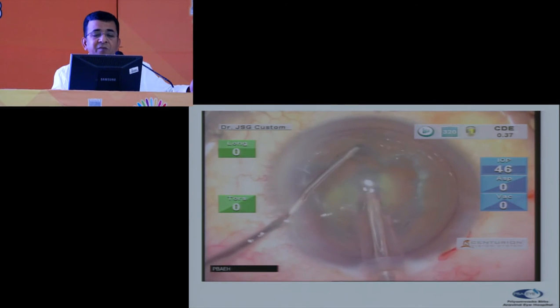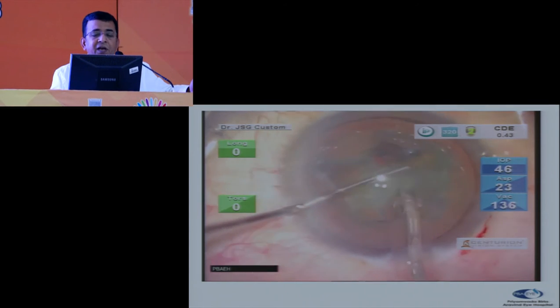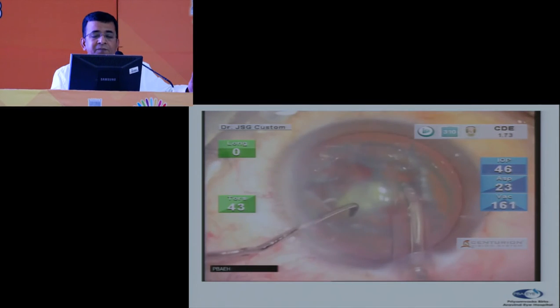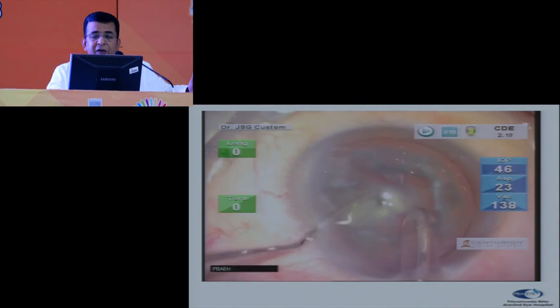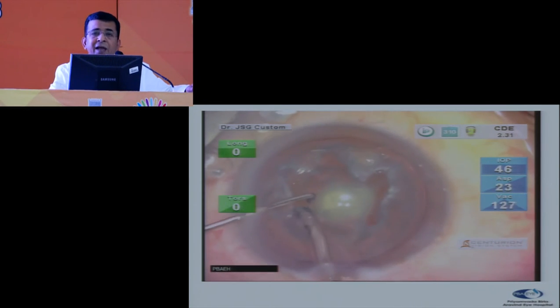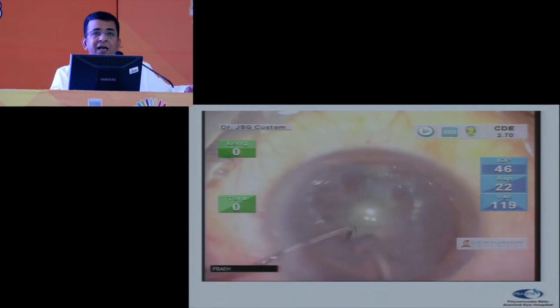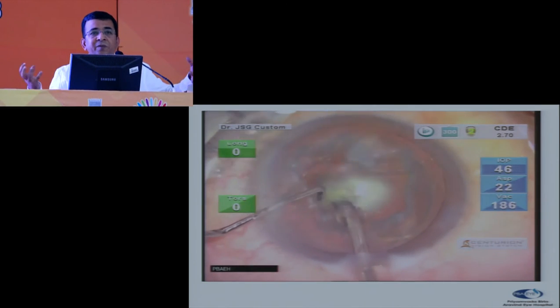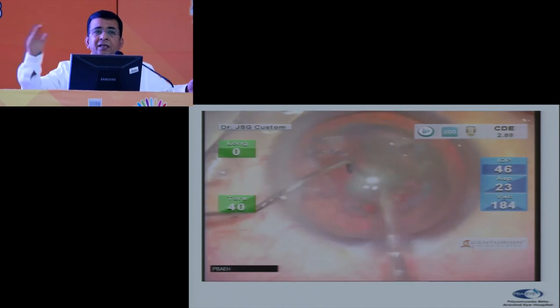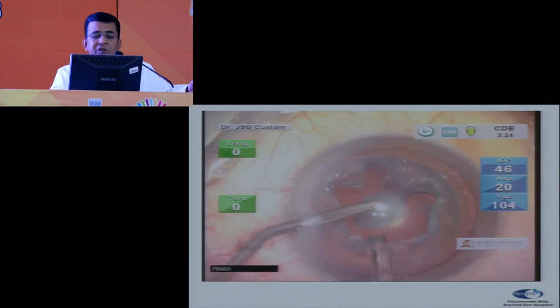And as we start off the process, it's a softer cataract, so we just initiate a primary grab without opening the window much and take out the pieces one after the other. So when we are looking into the settings, we must understand that irrespective of whatever I keep, I may have a vacuum of 650, 700. How many times do I reach that? All of us have a sweet spot. Whatever be the setting, we ultimately land up in that sweet spot irrespective of what we keep as our base and the height. So reaching that sweet spot in every case is probably the most important thing.